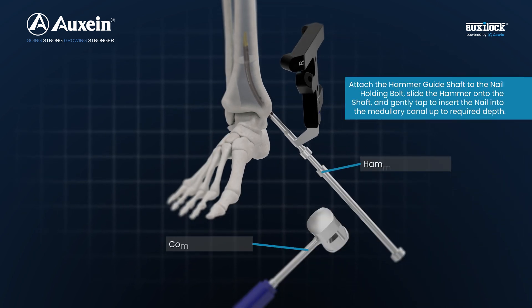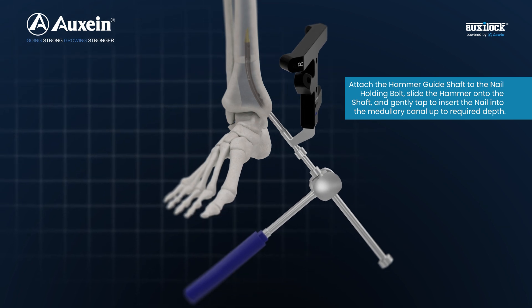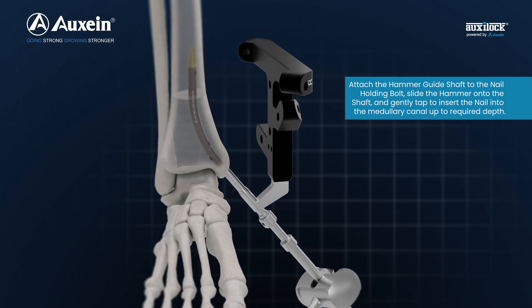Attach the hammer guide shaft to the nail holding bolt, slide the hammer onto the shaft, and gently tap to insert the nail into the medullary canal up to the required depth.